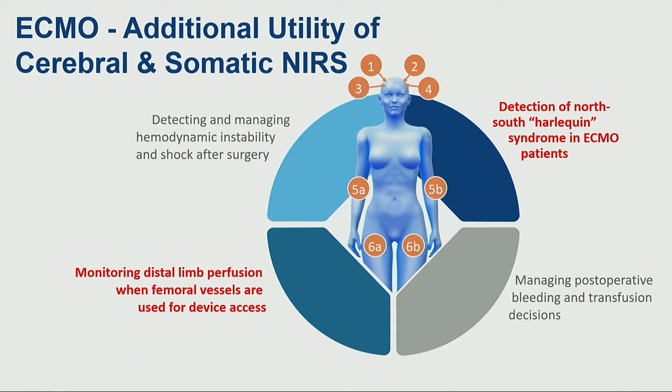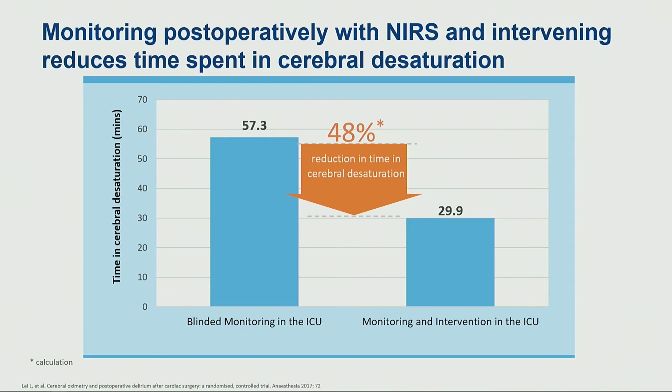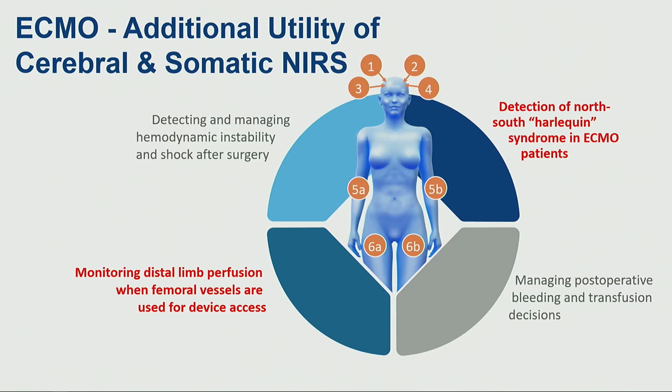Again, you are going to think and ask me, is there a clinical correlation to all of this? I will tell you that studies that have been done are small randomized trials that have shown that there is a clinical correlation. However, we need to do larger pragmatic trials where we can build on evidence like this. If there is indeed a 50% reduction we can achieve, how do these patients that have a 50% reduction do compared to those that continue to desaturate?